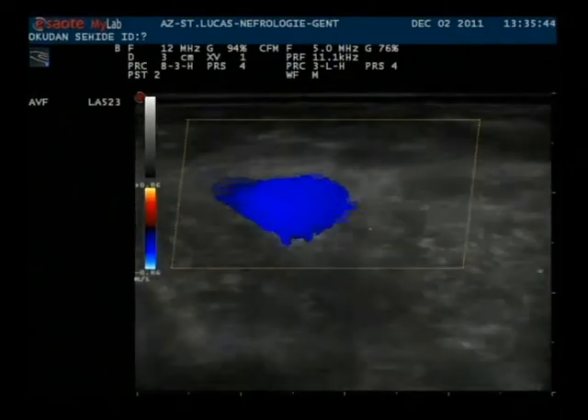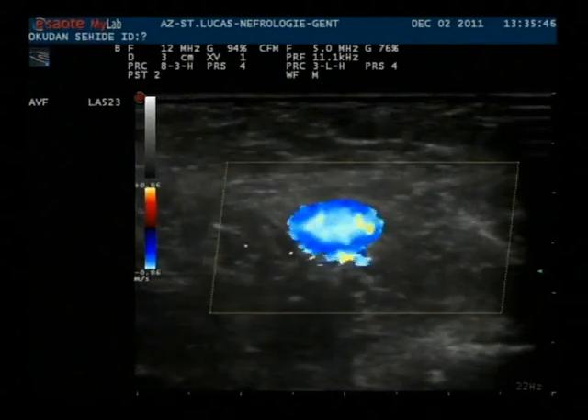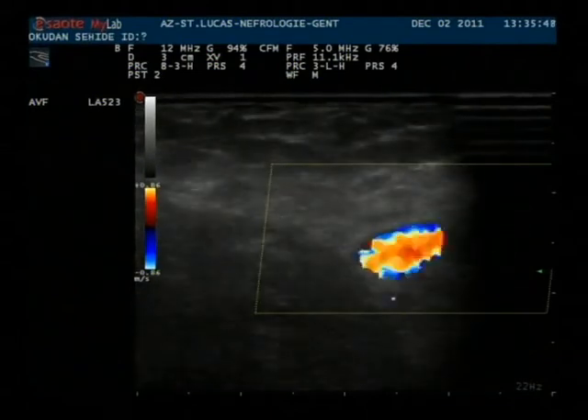Now we follow the vein a bit more centrally where it goes into the depth.